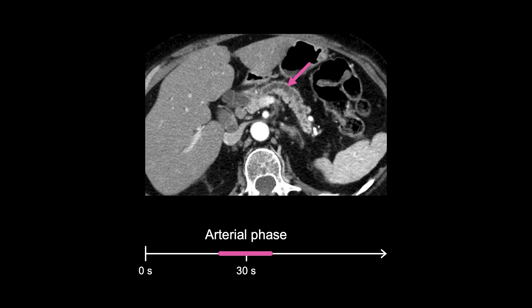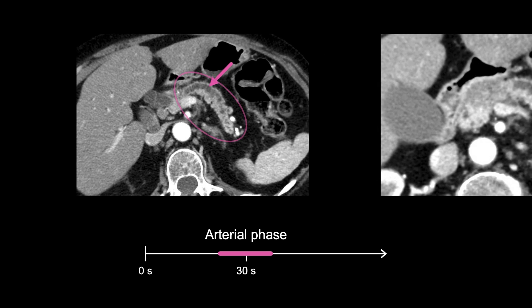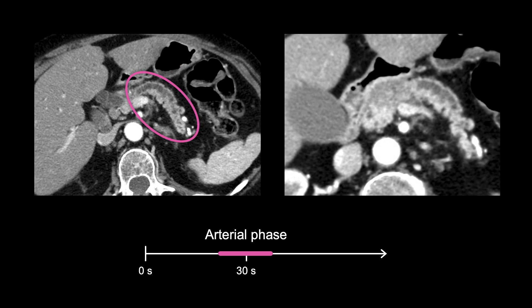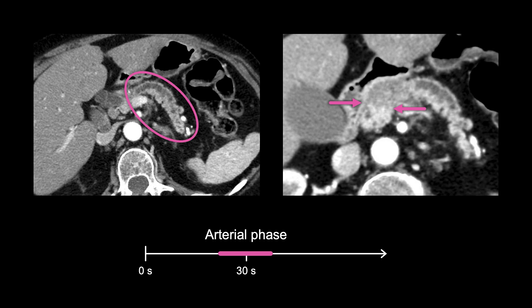If we zoom in, you can see a relatively subtle boundary between the pancreas tissue and the mass, which has decreased enhancement. On the other side, the dilated duct leads right into the mass, helping to identify the boundary.